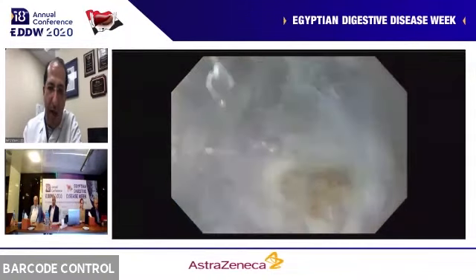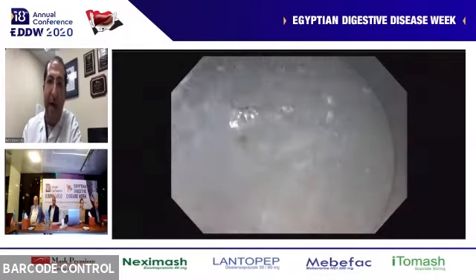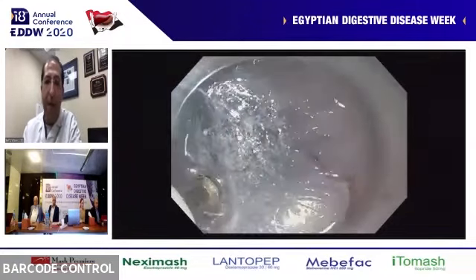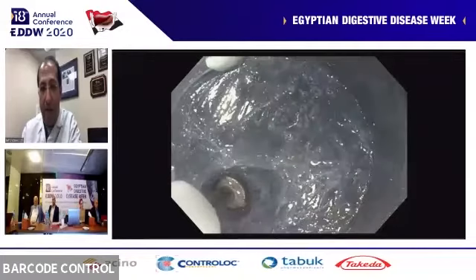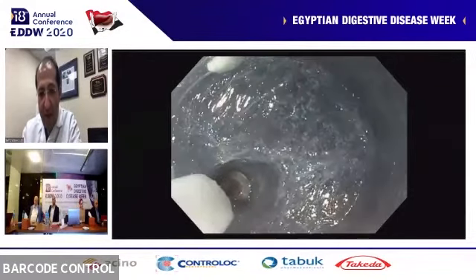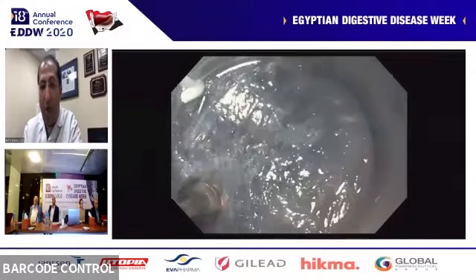As you can see, now I'm using my water pump to slide under the surface. The surface is up top at 12 o'clock. Now this is third space. I'm working into the submucosal space. I'm very careful. I'm working very close to my muscle, away from my mucosa. My mucosa is up top at 12 o'clock. I don't see it. I'm working very close in the muscle. Any little vessel that I see, I coagulate. I don't like to work deep and far. I work shallow and close.